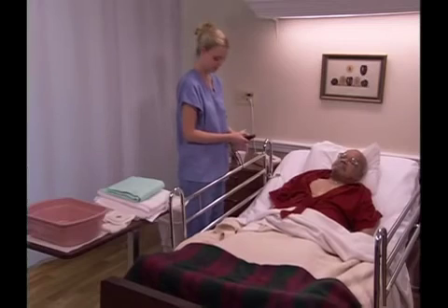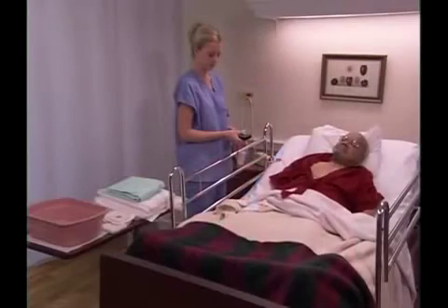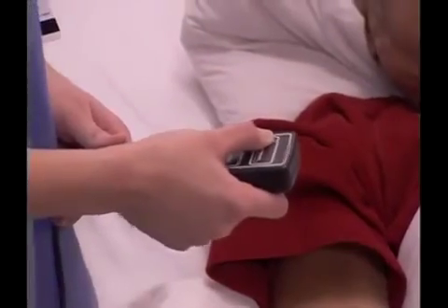Position the bed at a comfortable working height to promote good body mechanics. The ostomy appliance can be changed with the person sitting or standing in the bathroom, or while the person is in the bed. The procedure is easiest when the person is sitting upright or lying flat, as in this example. If necessary, lower the head of the bed so that it is flat as tolerated.